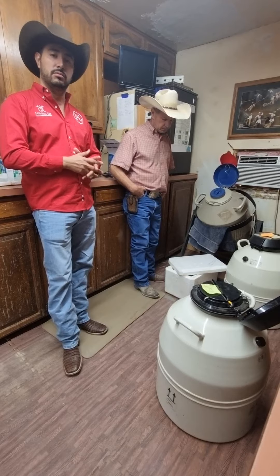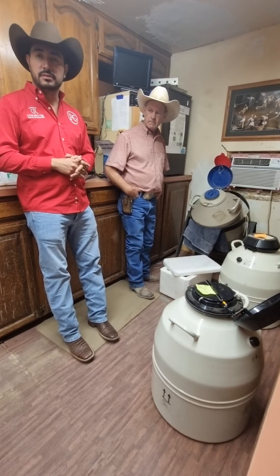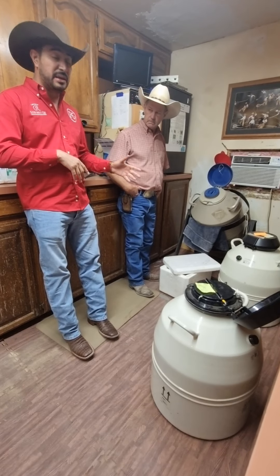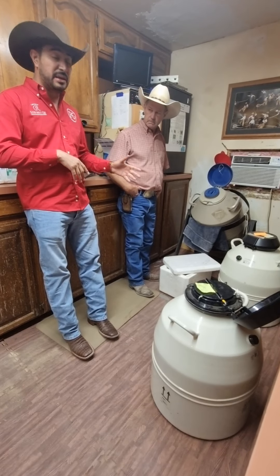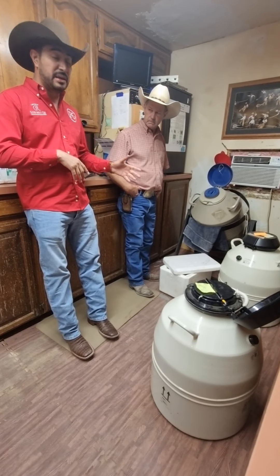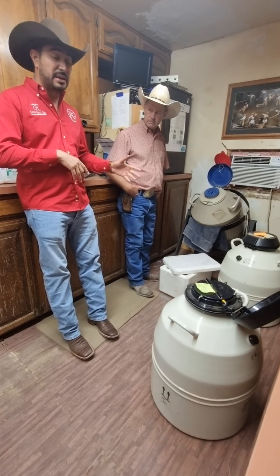After 20–25 minutes in the vapor, we're ready to pick them up and drop them into the liquid nitrogen. Once you drop them in the nitrogen, we gather them up and put them in our tanks. We need to wait 20–25 minutes in the vapor, and then another 20 minutes in the liquid. Once they drop into the liquid, they're frozen. We gather them right away and put them in the tanks — and they're ready to go.